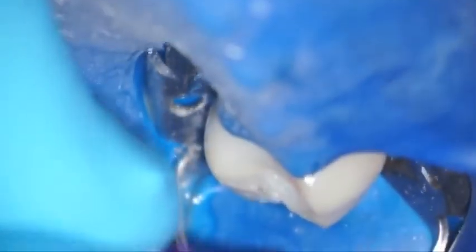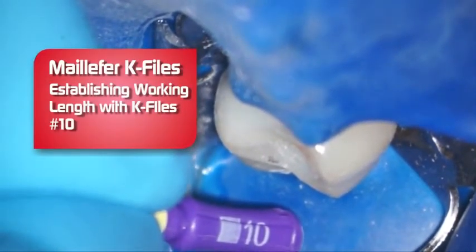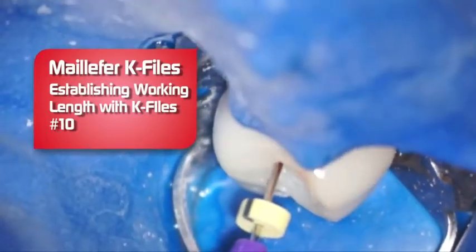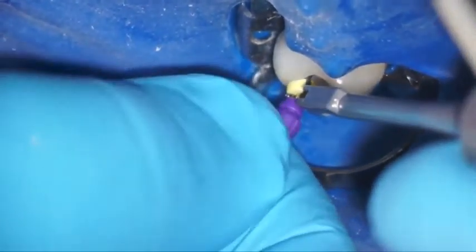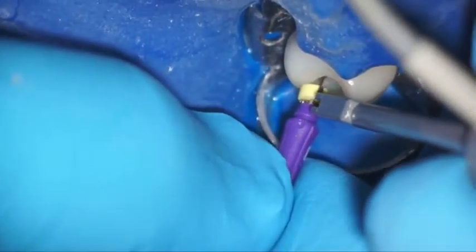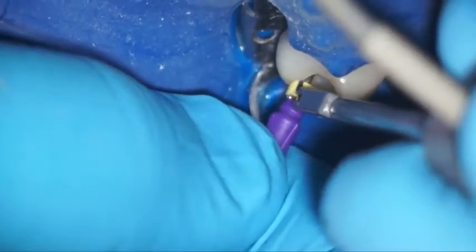We're going to establish our length here with a number 10 K-File, which is very, very thin and very flexible — just an easy file to use. I like to use the 6, 8, and 10s to get around any curvature. And here we go, confirming our length.